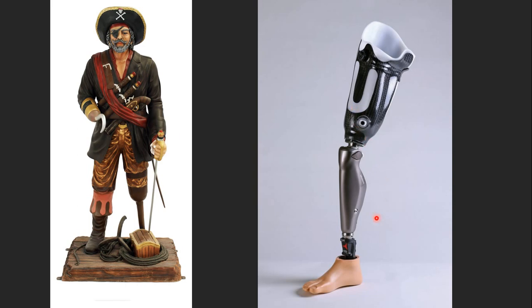Over here on the right, we have this advanced prosthetic leg, and you can see that it's not just a piece of wood, right? It has a joint on the bottom. Maybe it's soft, so it can grip the floor better. Maybe it's better suited so you can put your leg in here and attach the prosthetic device to yourself. So it's just much more advanced compared to the old style prosthetic device.